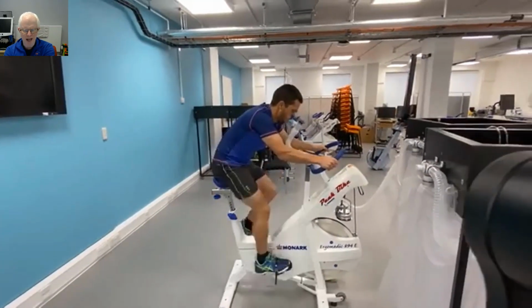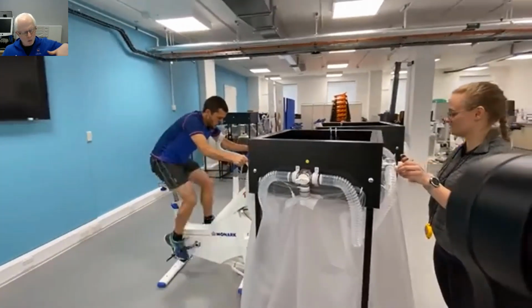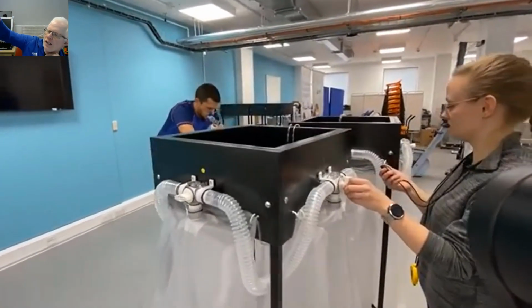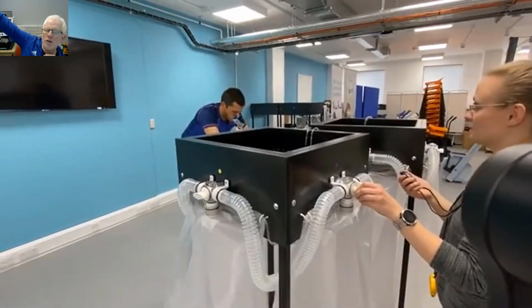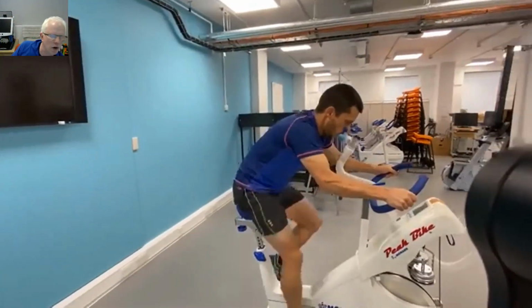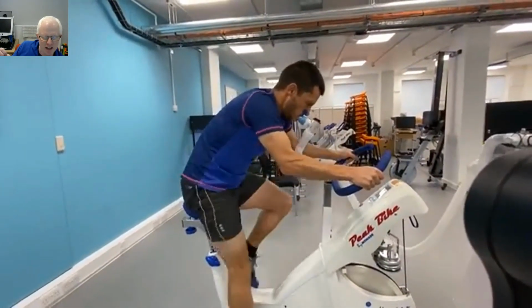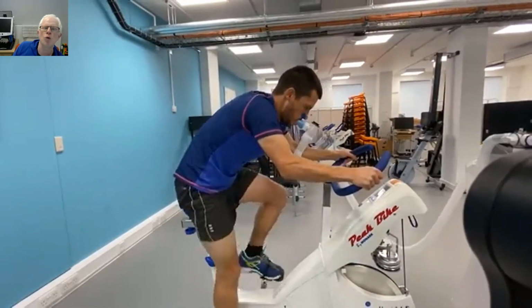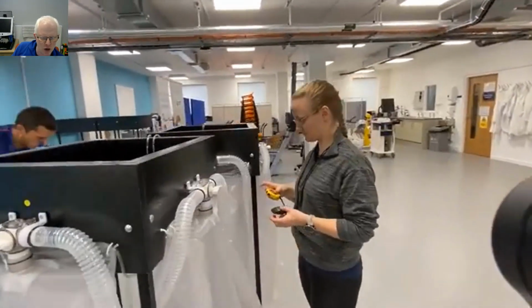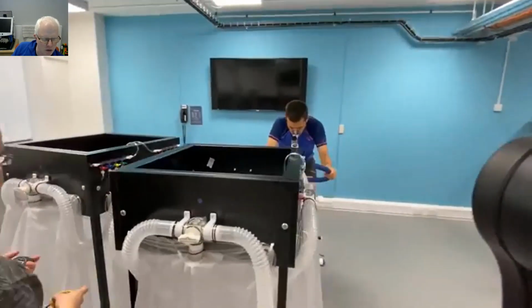We're now into the third bag. Now the anaerobic contribution is getting high. He's getting closer and closer to VO2 max. He's struggling to get all the aerobic energy in, so now we're taxing anaerobic metabolism. We're just pushing and pushing and pushing. The key to the test is you have to go to volitional exhaustion, because you've got to find out how big his capacity is to work anaerobically. We're now onto the fourth bag. We've gone a minute and a half. Remember, these are 30-second collections.